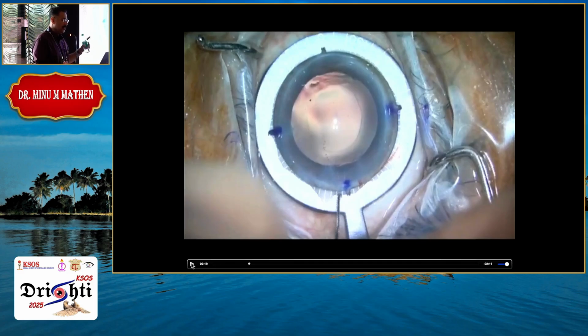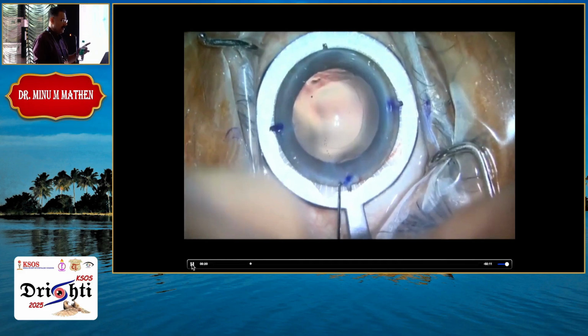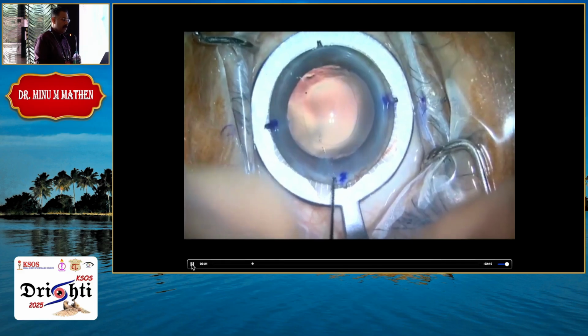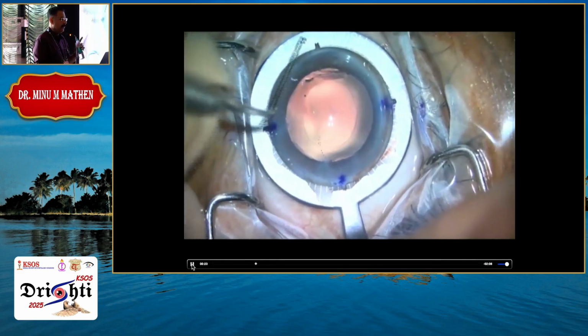See, sometimes if there is ballooning, if it is blocked, there will be ballooning of conjunctiva. Please wipe off all the, what is that, chemosis, and then place this one properly. See, this one again, the placement has to be exactly around the limbus. If one side is more, you may go wrong. So, identify and dry it very well, and then mark.